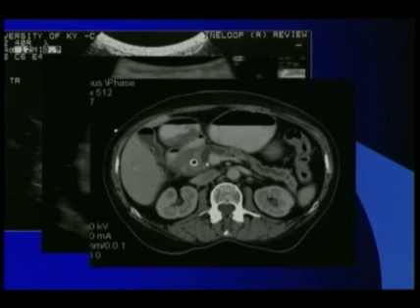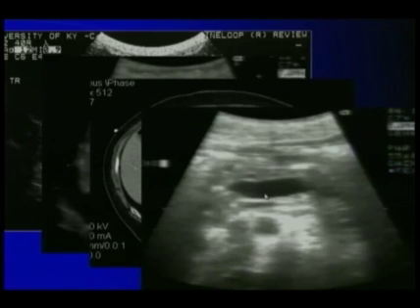In this case, you see the dilated Wirsung duct, this is the CT image. We placed the CBD stent to this patient. As you see here, it seems like it's difficult to assess the Wirsung duct without penetrating the stomach. This is one more case with severely dilated pancreatic duct due to acute pancreatitis, and you see anterior and posterior walls of stomach located anteriorly between pancreas and anterior abdominal wall.